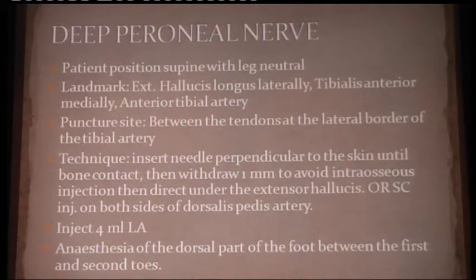The ankle block, recently within the last 6 months after the discussion on the group, I have modified it. It has now been seen that we can use the peripheral nerve stimulator for locating the deep and superficial peroneal nerves also, that I will show later on. First, initially the way I used to do earlier for deep peroneal block, thinking that it's only a sensory nerve, so PNS cannot be used.